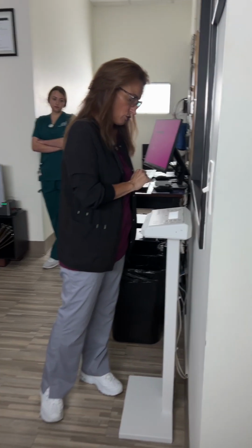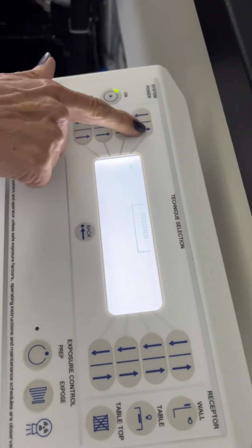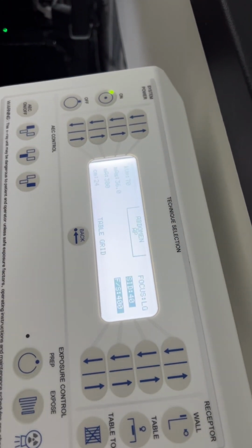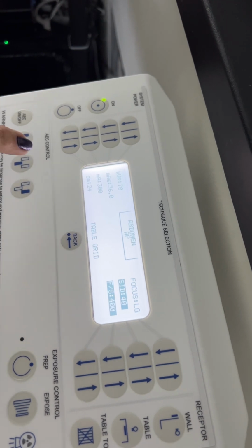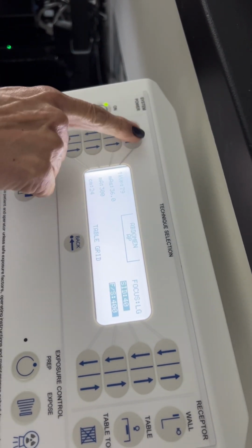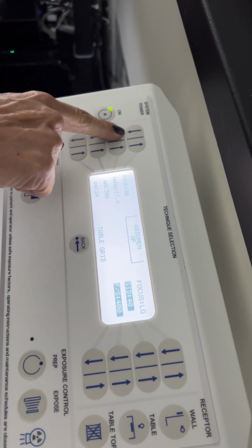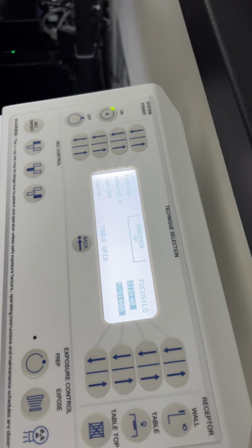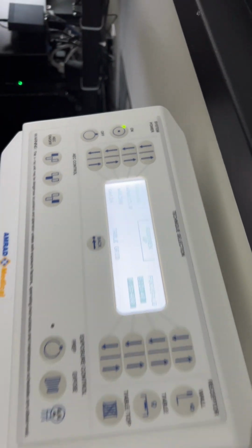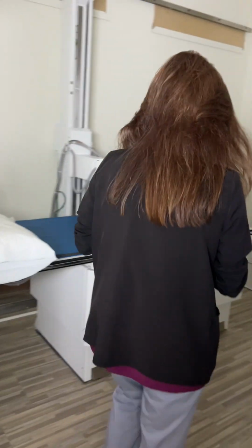So we're going to choose abdomen on here. It only gives us AP, which is fine, even though it's upright. We're going to be at a 40-inch SID, and on a sthenic patient, it would be 80 at 12.5. And on my patient, I'm going to go 80 at 15. So that's set when I'm ready to go. And then we'll come in here.